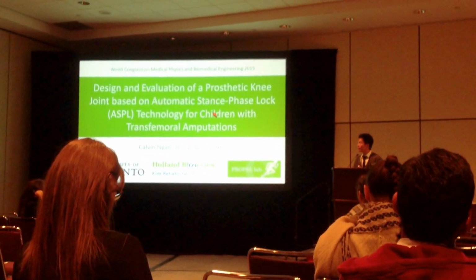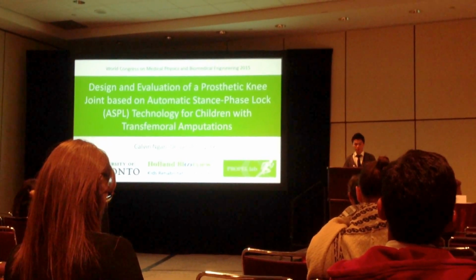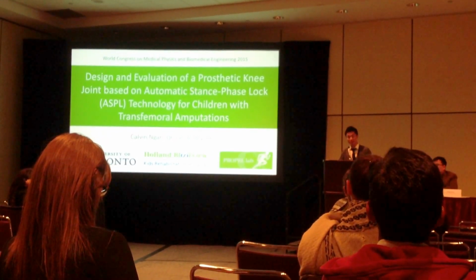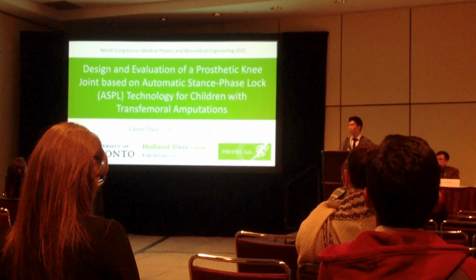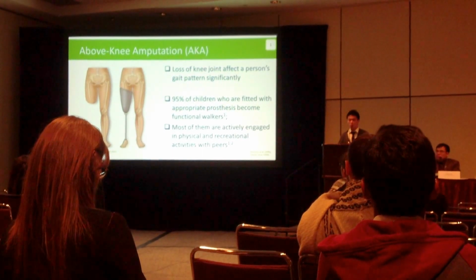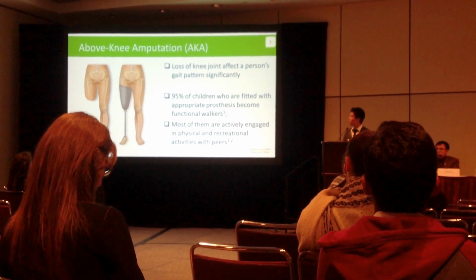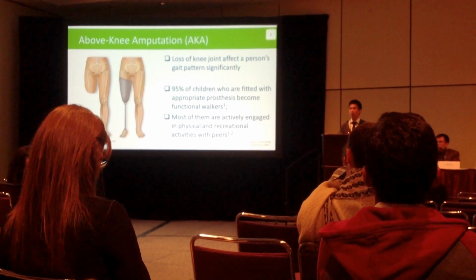Hi, my name is Calvin, and today my thesis project is the design and evaluation of a prosthetic knee joint-based automatic stance phase lock technology for children with transfemoral amputations. Transfemoral amputation is also known as above-knee amputation, in which the amputation occurs in the thigh.